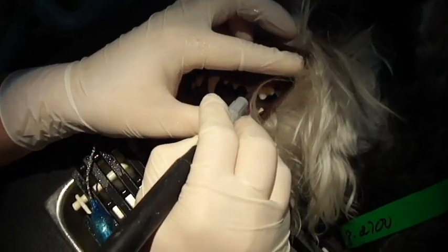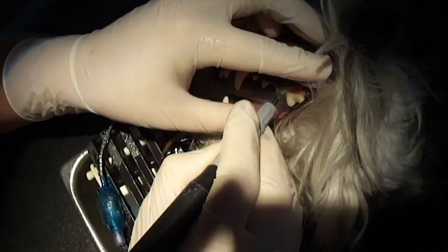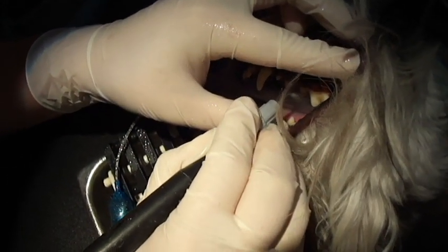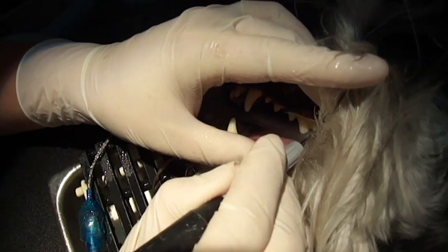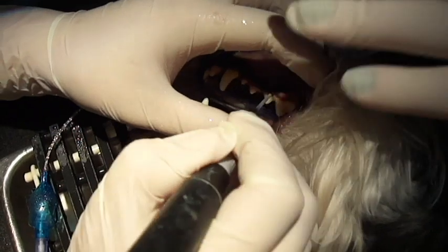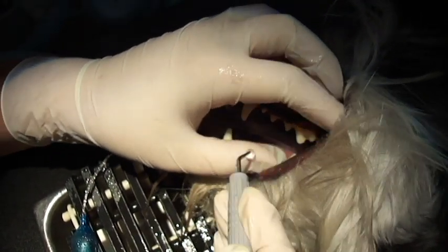How many? Right now I'm trying to see all this. Four — three molars here. Great job, Stan. Get a shot of me cleaning under the gum line. That's a good one.